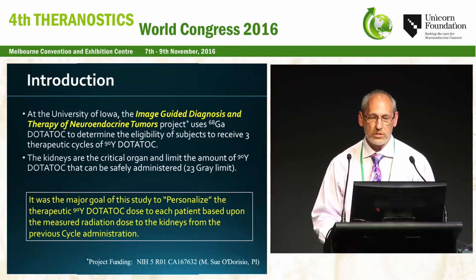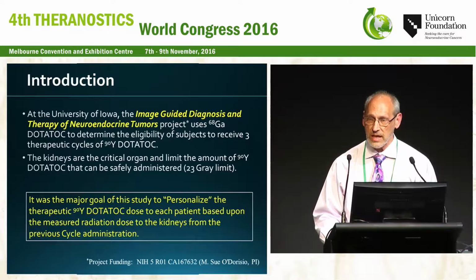This project is entitled Image-Guided Diagnosis and Therapy of Neuroendocrine Tumors. It's an NCI, National Cancer Institute funded project, and we use gallium-68 DOTATOC to determine eligibility of patients to receive 3 therapeutic cycles of yttrium-90 DOTATOC.